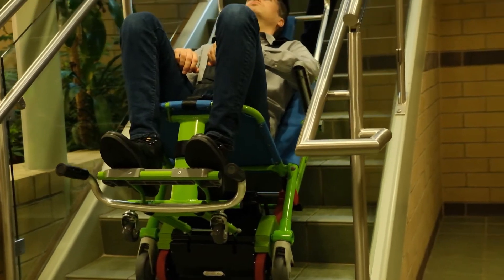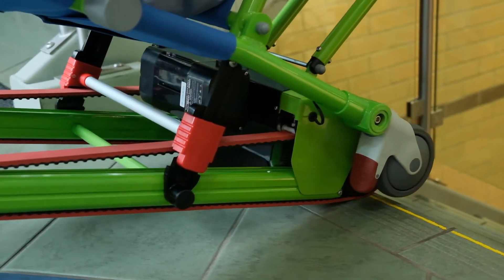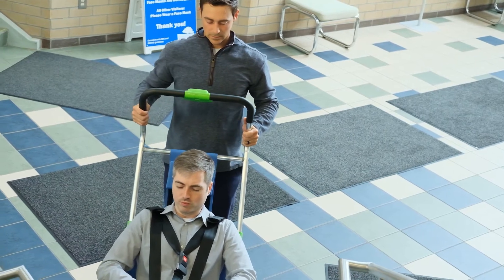While ascending, keep downward pressure on the handle and walk backward up the stairs while still holding down the motor button. Once you reach the top of the stairs, place one hand on the side of the handle, move away from the top step, release the motor button, and return the chair to an upright position.